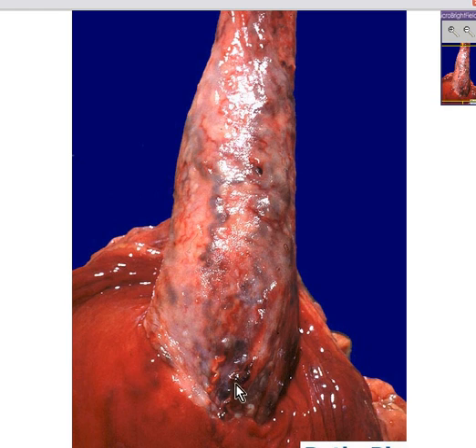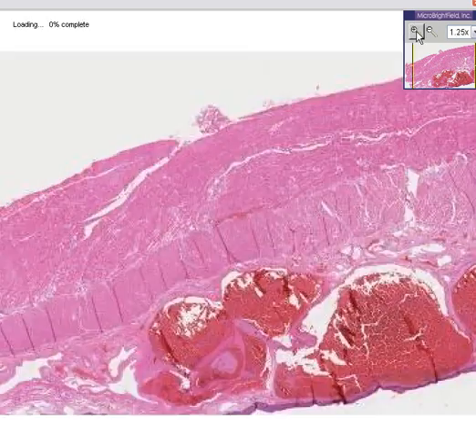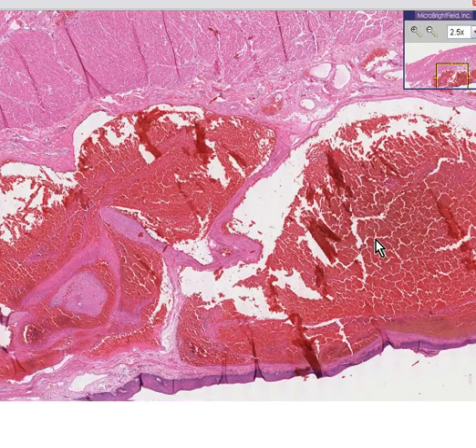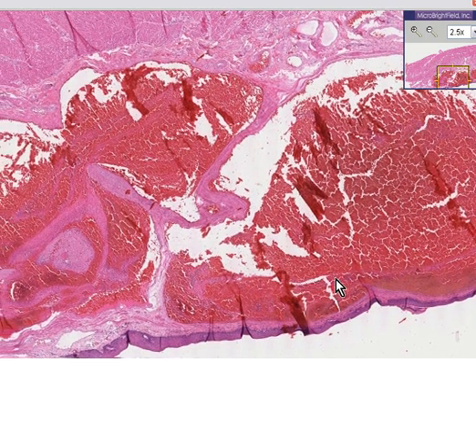This one could very easily have been a bulging vein which ruptured. And why would they rupture? Well, here is the same vein in the esophagus. You can see the smooth muscle of the esophagus here. This was the lower part of the esophagus, so you're not likely to see much by way of skeletal muscle. And you can see that these very, very large mucosal and submucosal veins extend very close to the surface.